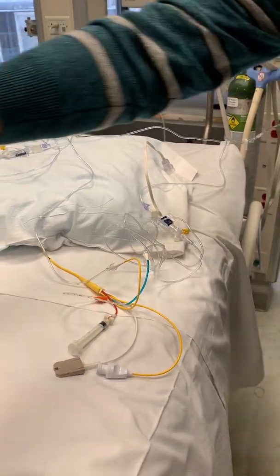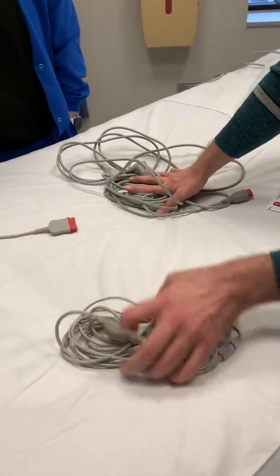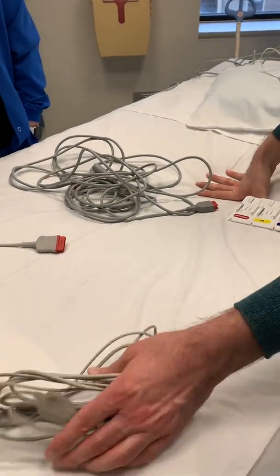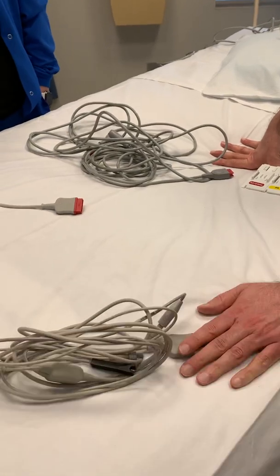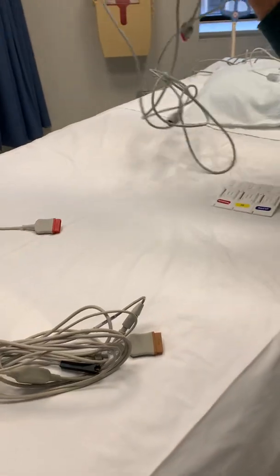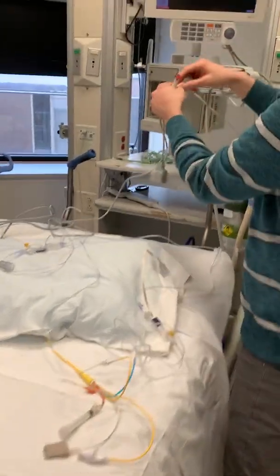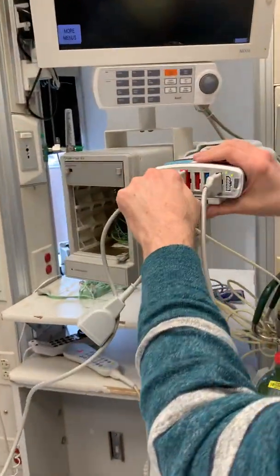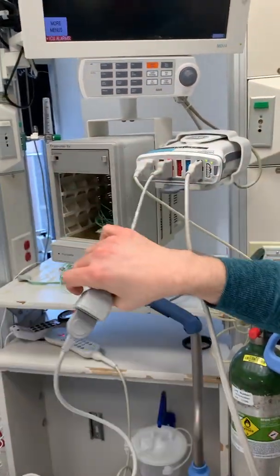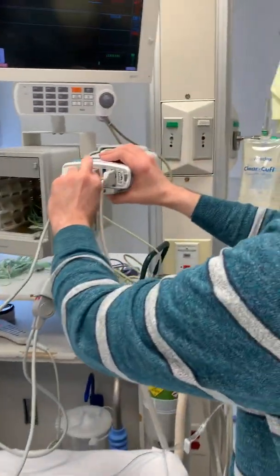The other thing you need are your cords. There's going to be two red pressure cables. You're going to need a splitter, especially if the patient already has an A-line, which most of the patients do. And then you need your brown cord that has your temperature setup for your cardiac output.